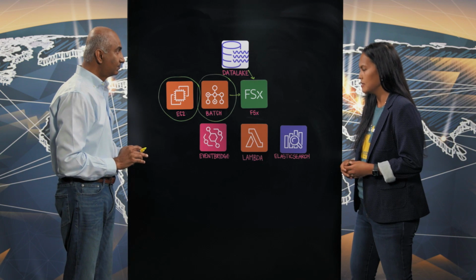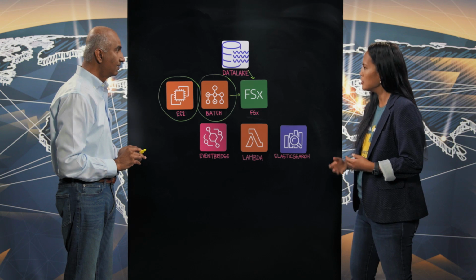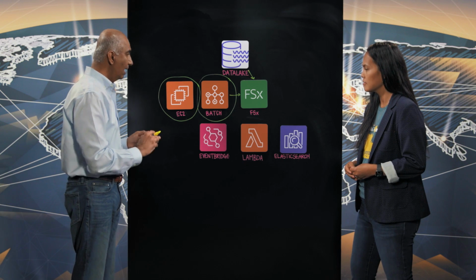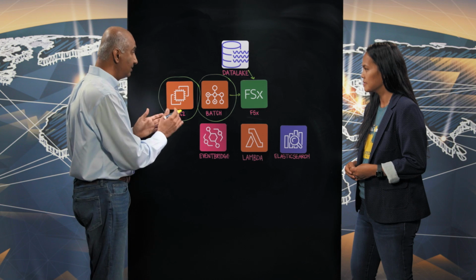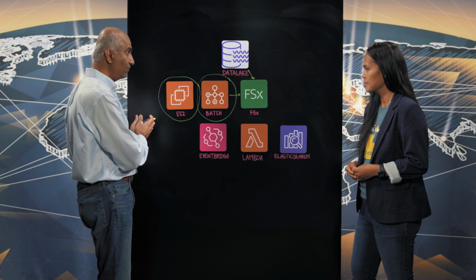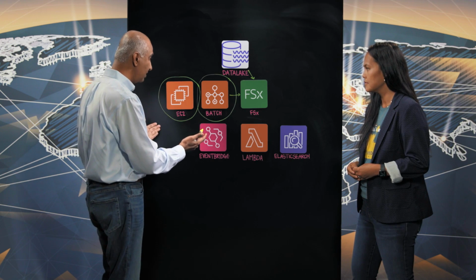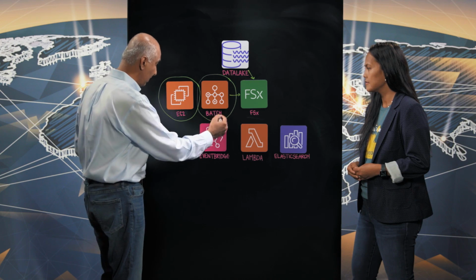As a batch process, there must be long processes where you may have quite a bit of errors. How do you manage that? At the time of processing, definitely, this is a multi-day job for most of it. Depending upon the data sets, it can take anywhere from 2 to 7 days. If errors happen, we identify them this way.